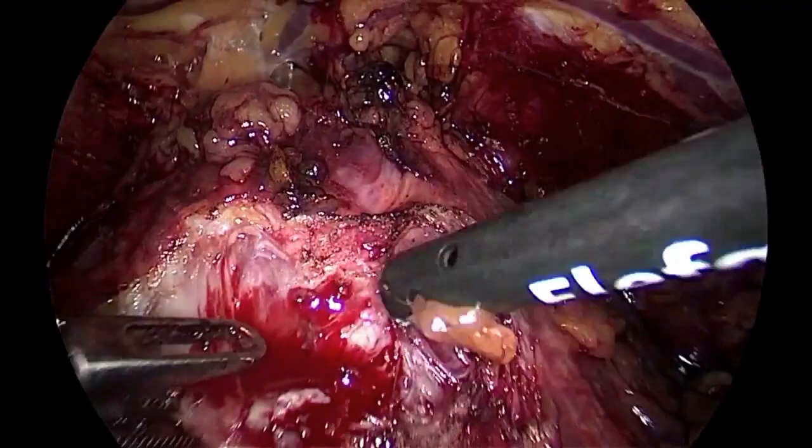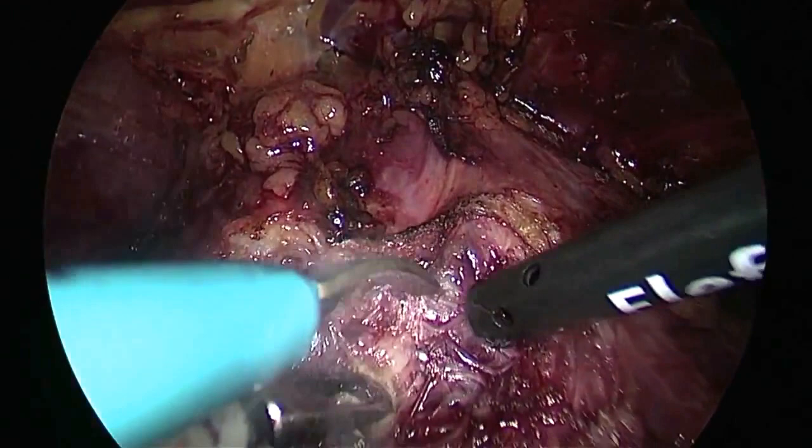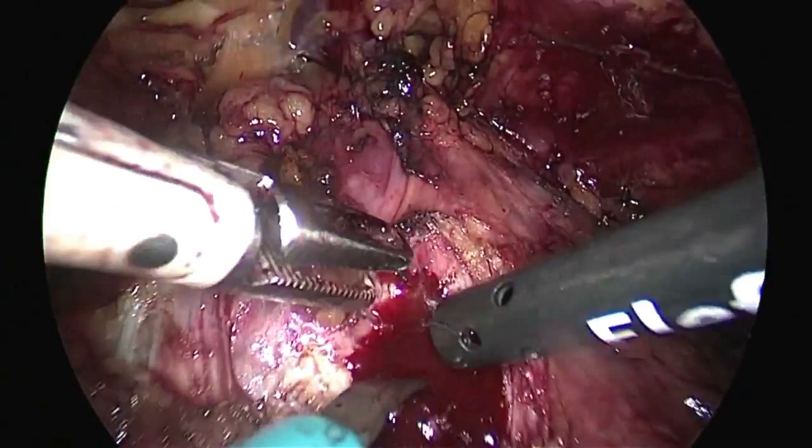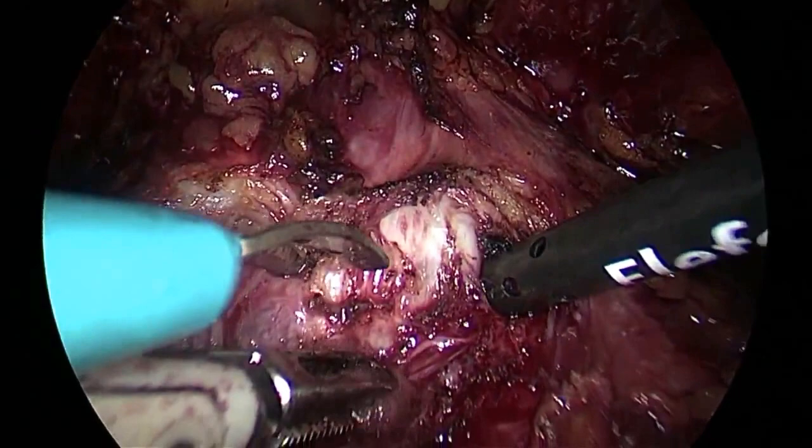Coagulation. Okay, step by step here. Coagulation, please. Monopolar.